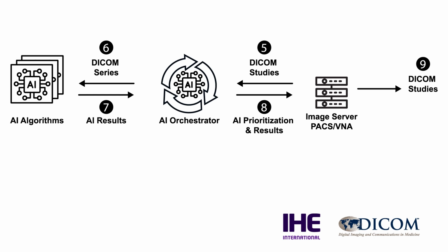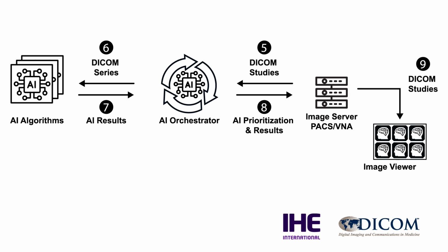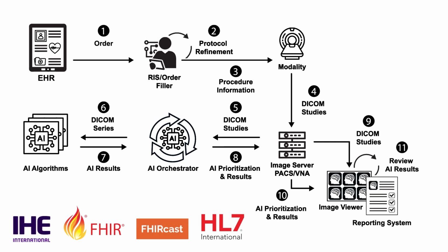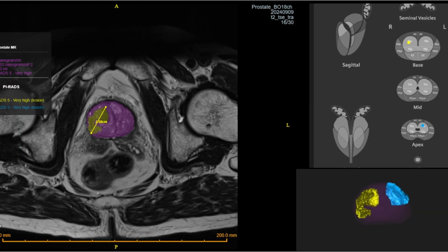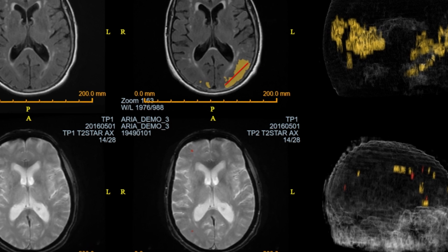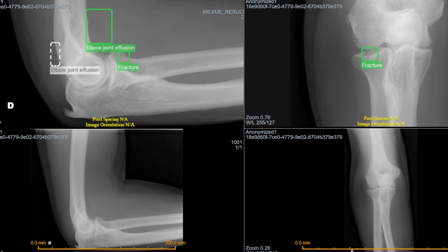Another way AI can enhance radiology workflow is automating the prioritization of reading work lists. Interpretation worklist managers consolidate input from variables including workload and radiologist availability to allow timely review of results for urgent findings. Finally, the AI results are presented to the radiologist to review, edit, and accept or reject. AI results can include overlays such as segmentations or measurements on an image. AI results, such as ARIA findings or PI-RADS assessment categories, can also be sent directly to the report. The patient scenarios in this demonstration were designed to showcase actions for both acute and non-emergent findings. These cases demonstrate how using AI can improve efficiency of evidence-based care throughout the radiology workflow.